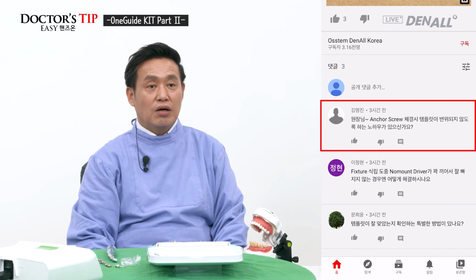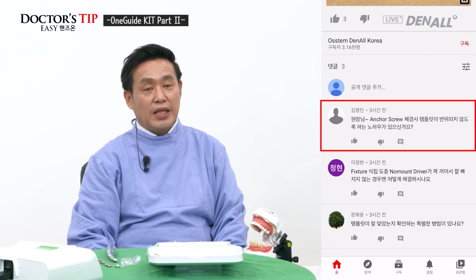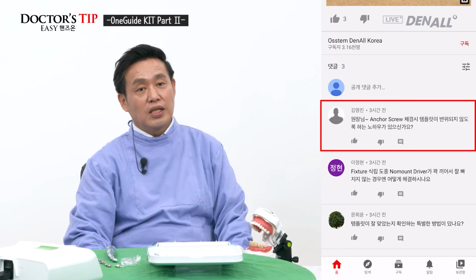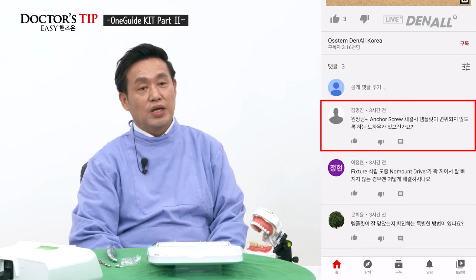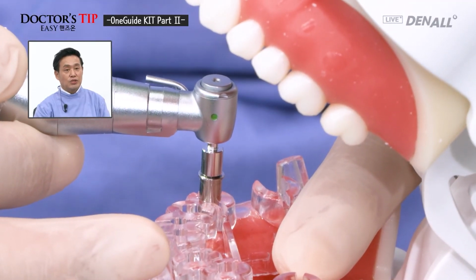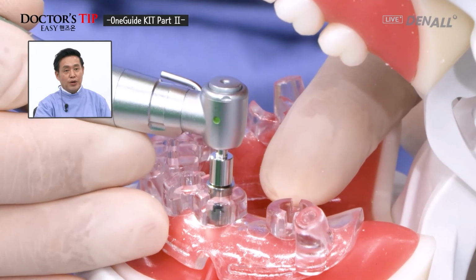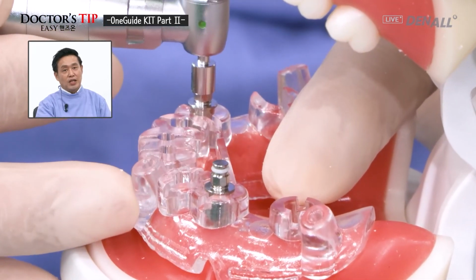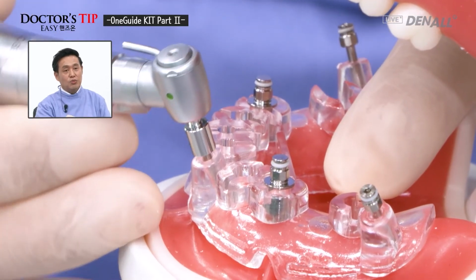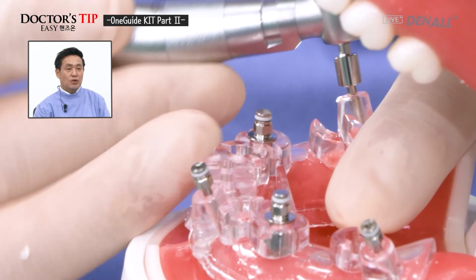Another point, when you connect, as I've showed you, the reason why we do vertical anchor first is because if you connect a lateral anchor, labial or lingual connection, they can be deviated. So that gingiva is not pressed too hard to check both sides and then connect the vertical anchor first. So vertical anchor is not fully connected. It's connected 80% and check position and connected fully. And if there is lateral anchor, there are 3 points. Do them in turn so that the template is not deviated.